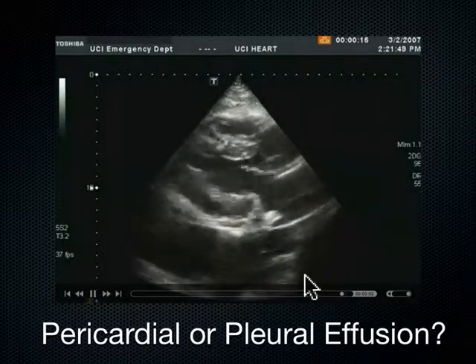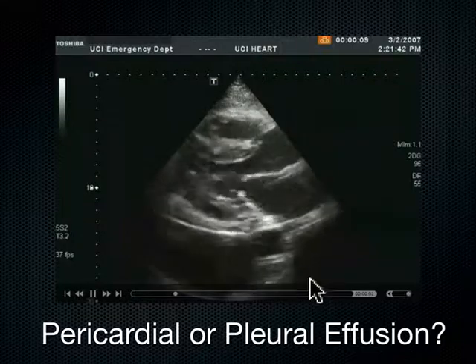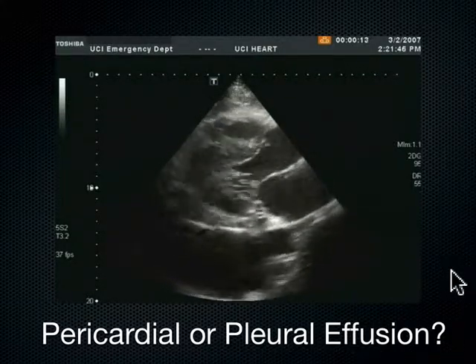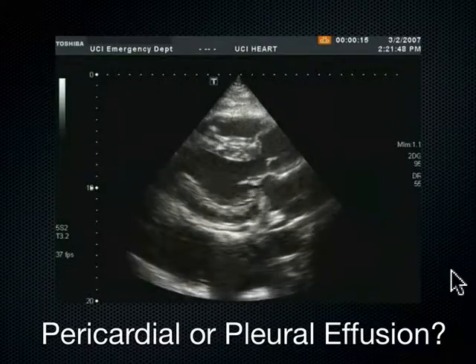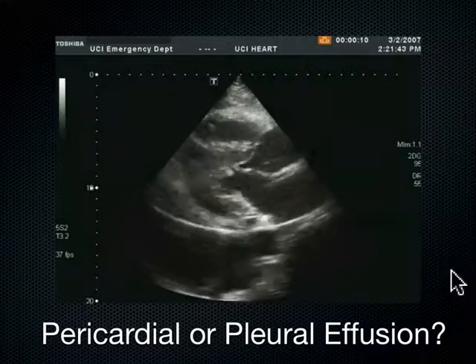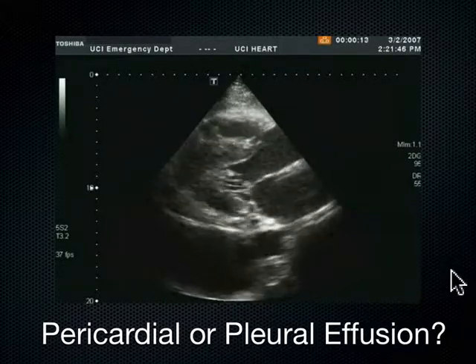This fluid comes along, as Dr. Landorf is saying here, posterior to the descending aorta, and therefore, this is a pleural effusion. Confusing. I agree. It looks just like a pericardial effusion. If it wasn't for that descending aorta, how do I normally diagnose a pleural effusion on the left?